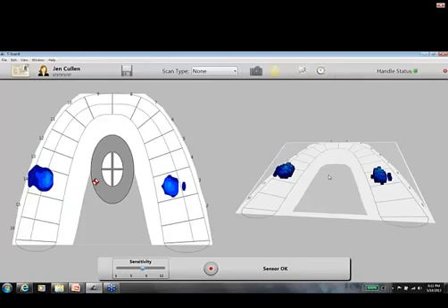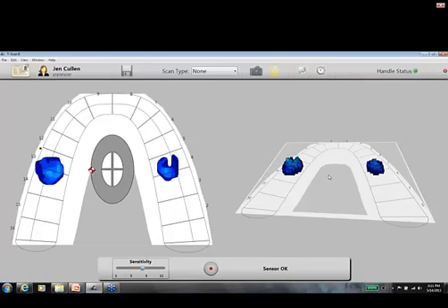The other thing we're looking at is what's the distribution of forces. And so that red and white diamond that's in the middle, if we had a perfectly balanced bite, it would show up in the middle. If we have more force on the left, it's going to show up over here. If we have more force on the right, it's going to show up over here.